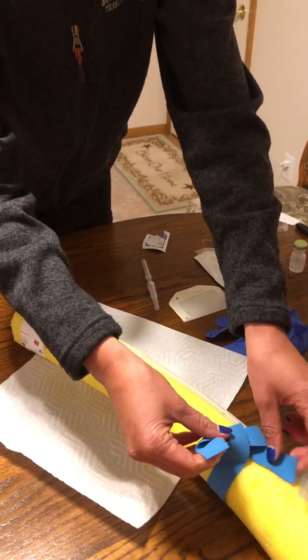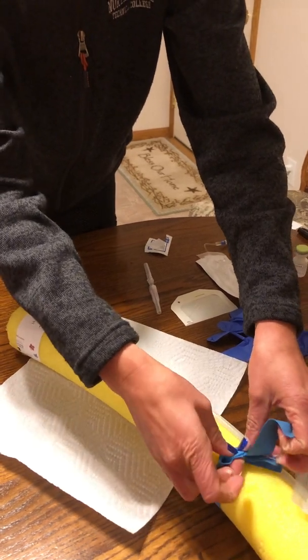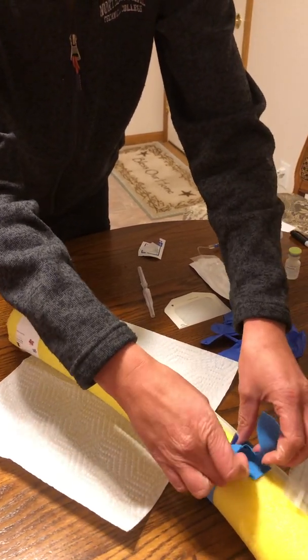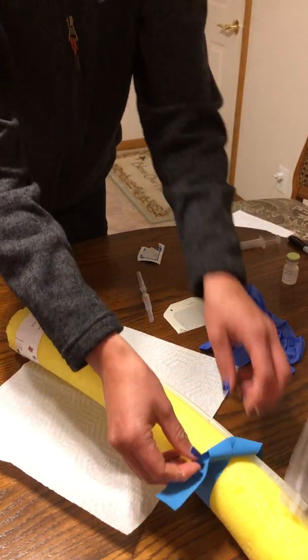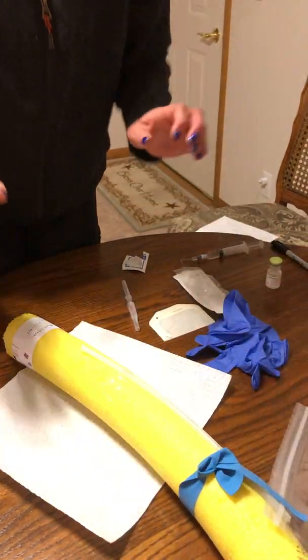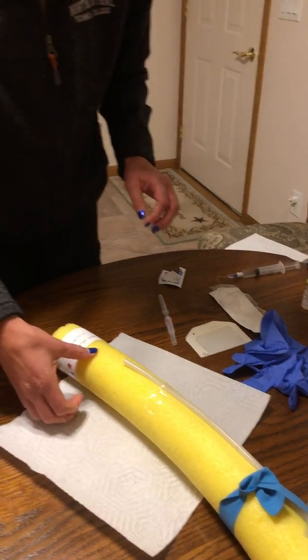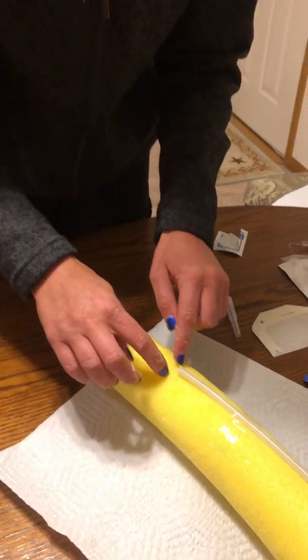And then once you have your quick release knot, now you want to make sure you have a pulse. And this patient has a pulse, good. And then I want to check to make sure that I find my vein.